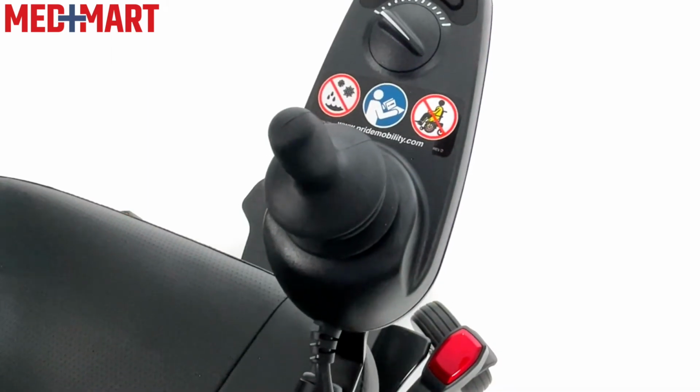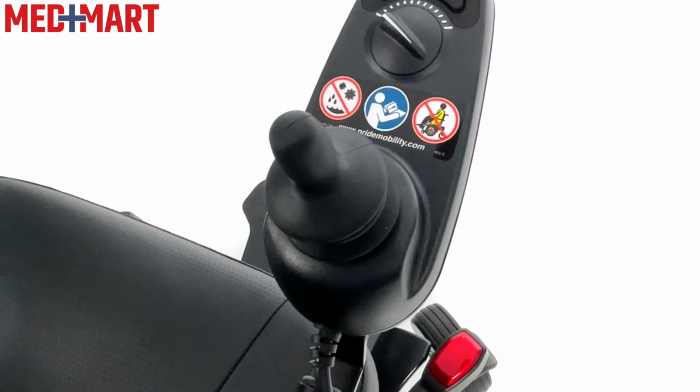If you're not familiar with a power chair, this is something that's called the joystick. We have the option of moving this from this side to this side. So if for some reason I've had a stroke, I've had some sort of injury to my right hand, or if I'm left-handed, I can easily move this over to this side. It's very easy to do that.